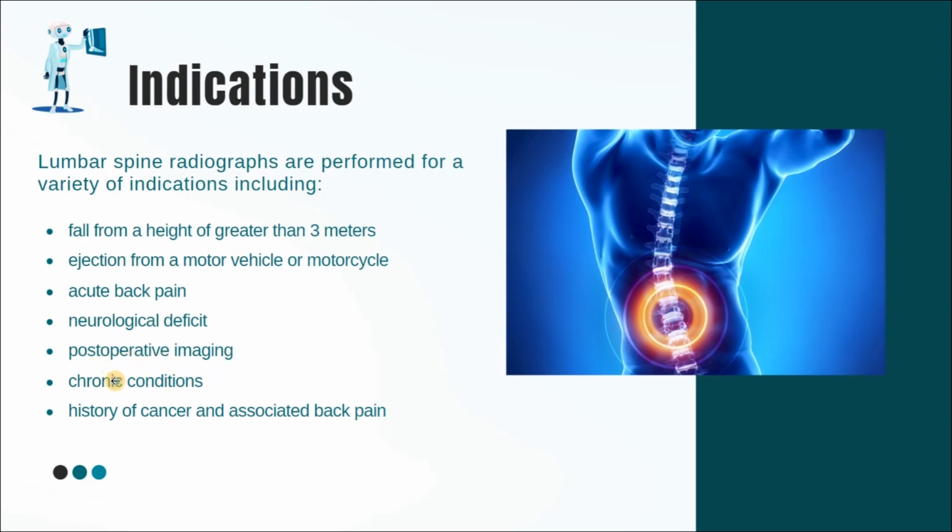In most cases, they are for chronic conditions like lower back pain, which may radiate to the lower limbs as well, and in patients suffering from cancer, like bone cancer, the one we call multiple myeloma. So the physician is looking for metastasis in the body of the vertebrae.